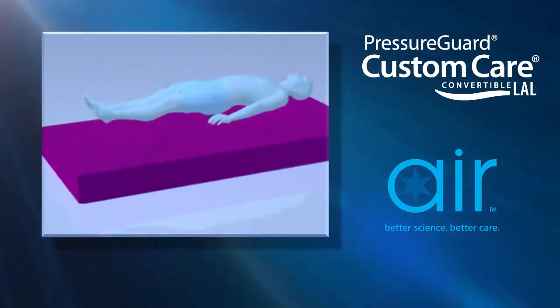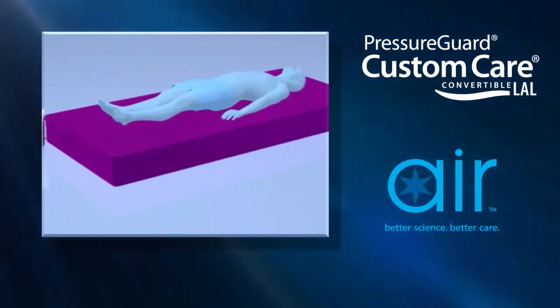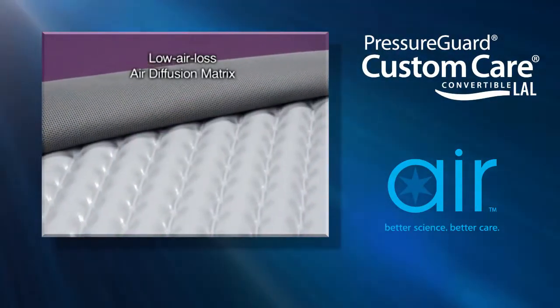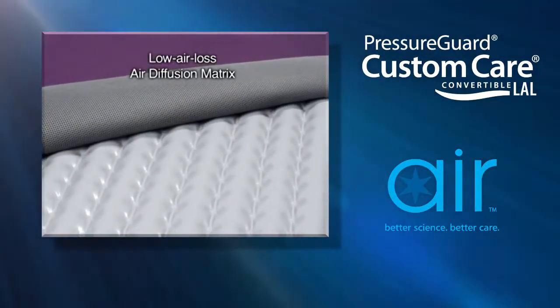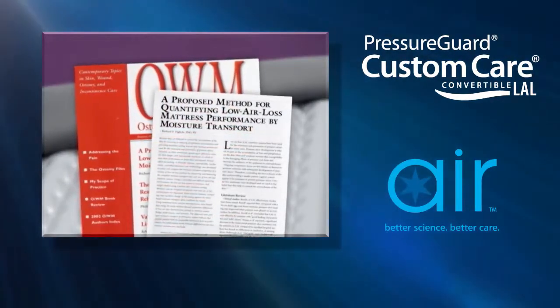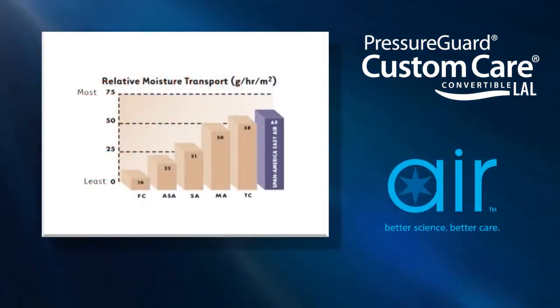The Custom Care Convertible LAL surface offers SPAN America's patented microclimate management technology for maceration control. A leading wound care journal documented its unmatched performance in the removal of excess moisture within the microclimate.